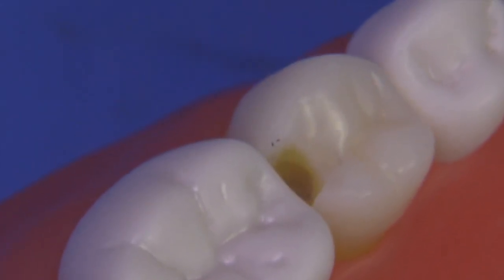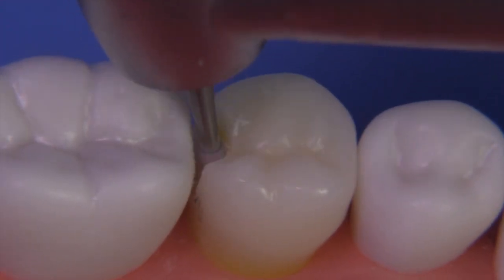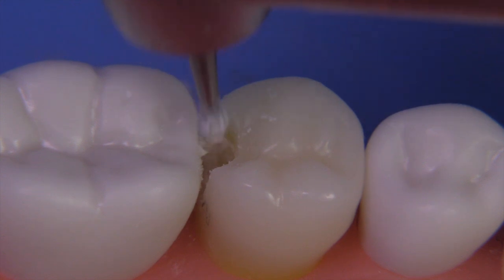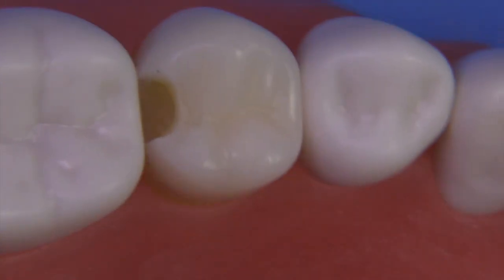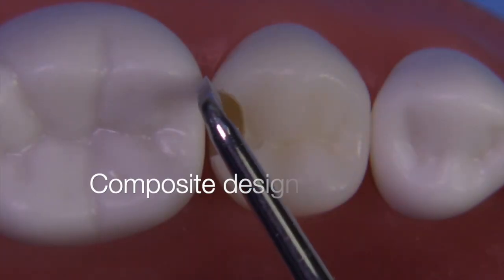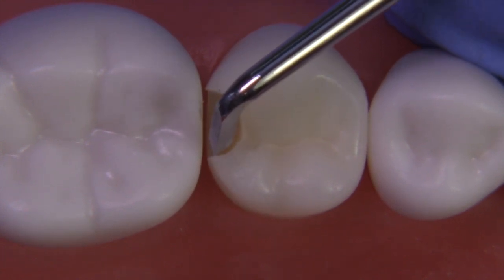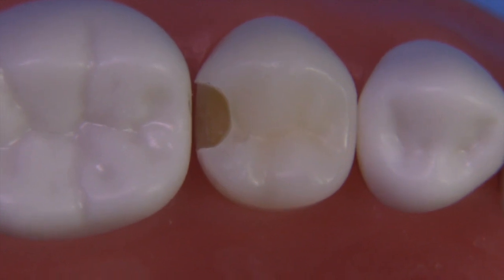We want to look at the periphery and understand that it may look less stained but there may still be soft areas, so it's a combination of visual and tactile assessment. Go back over the area with an explorer and make sure none of the periphery is soft. It's okay to have a little soft spot in the middle because we don't want a pulp exposure, but the periphery should be very firm. Now if we're doing a composite, it'd be nice to flare the walls a little bit — moving those exit angles out to a more flared state — which improves the retention and the seal of the composite up against those enamel rods.